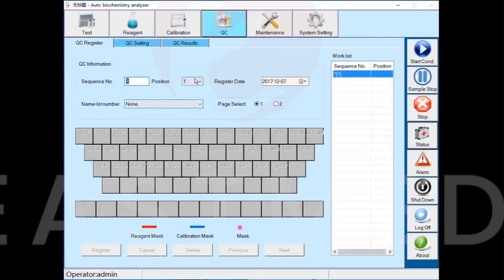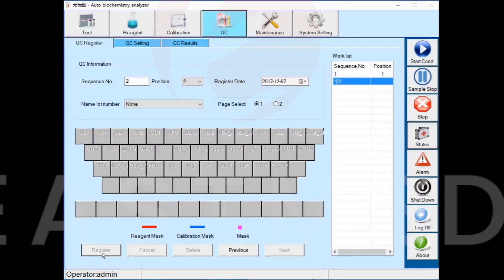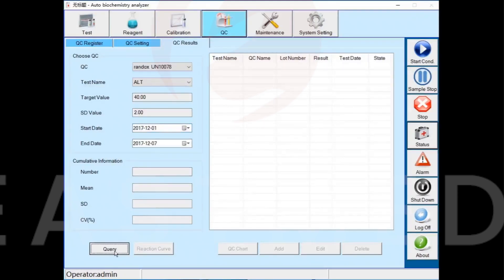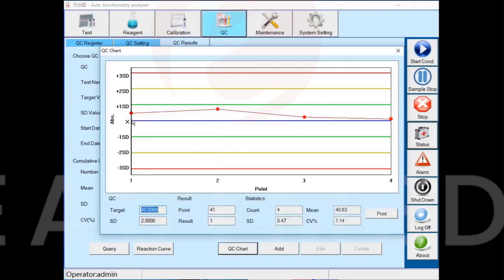Select the location of quality control, select the pre-set quality control parameters, and click the register button to complete the quality control registration. In the QC results interface, you can check the quality control results and view the quality control chart. The software supports quality control chart printing.